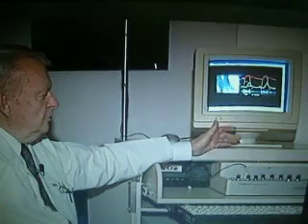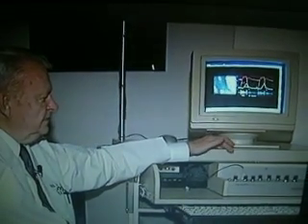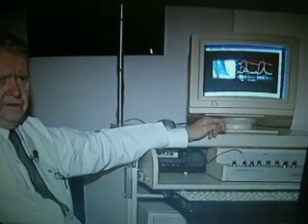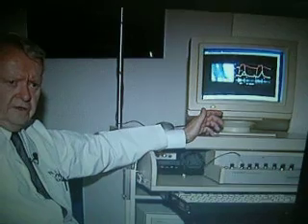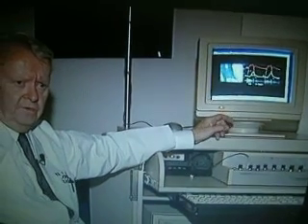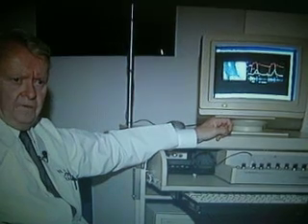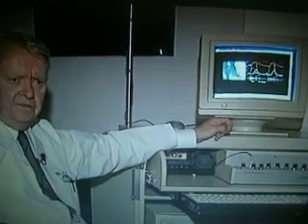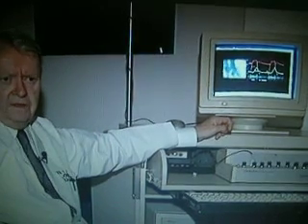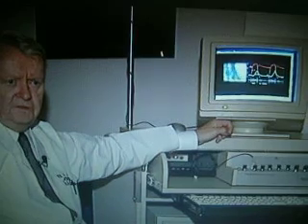One can record the actual bedside events in patients, let's say, with some unusual variety of heart sound or murmur, and place them on the hard drive of the laptop computer and subsequently put them on a CD with the anticipation that after a period of time and collecting enough of them, you can actually make a teaching CD that would be easily and inexpensively provided to students.